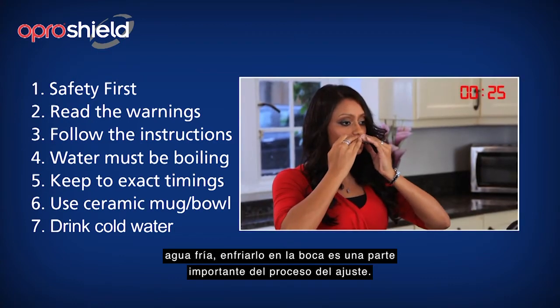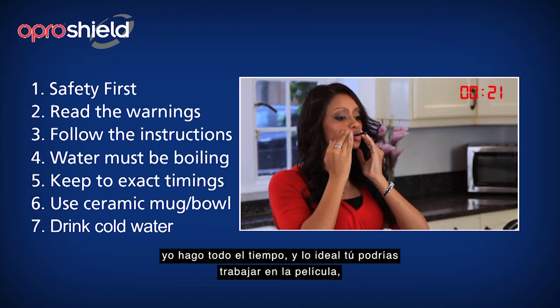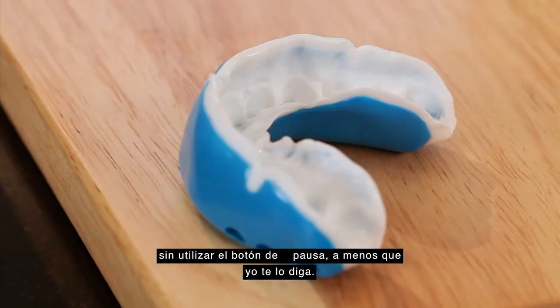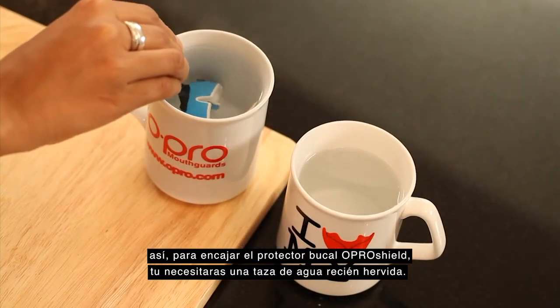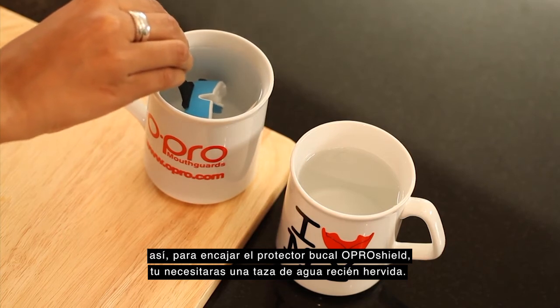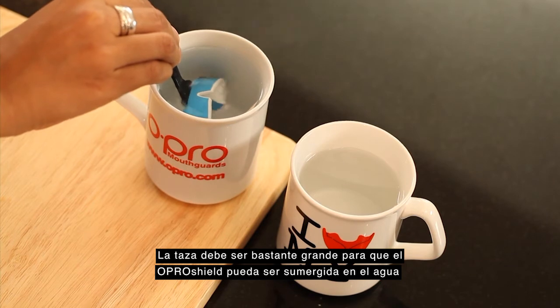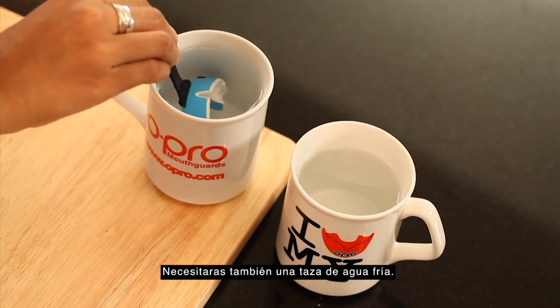And finally, the fitting instructions are filmed in real time. I do all the timing, and ideally you should work alongside the film without using the pause button, unless I tell you to. To fit the OproShield mouth guard, you will need a cup of freshly boiled water. The cup must be large enough so the OproShield can be submerged in the water without touching the sides or base. You will also need a cup of cold water.